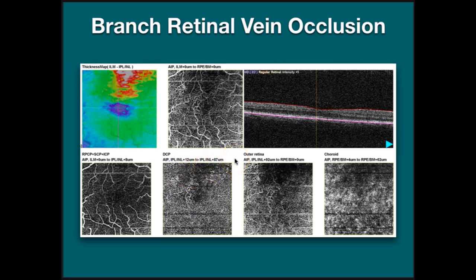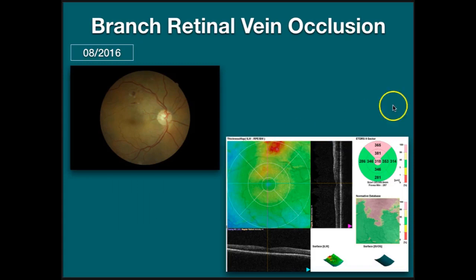So unfortunately, I was not able to decide if there was any significant capillary dropout at that time, or if it was just occluded by the thick layer of blood. The reason why we'd worry about capillary dropout is that it would lead to relative hypoxia in that area and may trigger neovascularization of the retina and then potentially neovascular glaucoma if there was a significant area of retinal hypoxia. So let's review the patient.